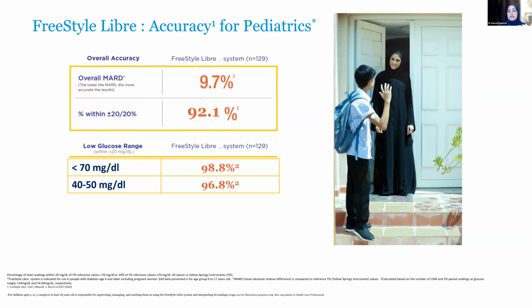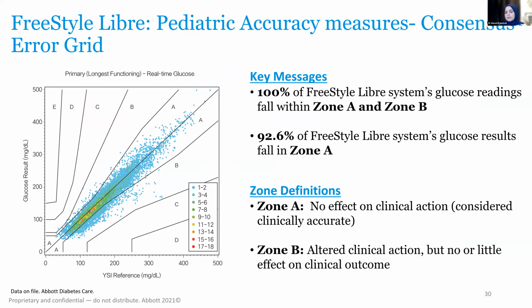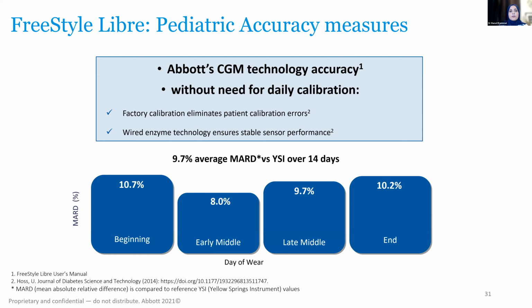And on the CEG, we had around 6,500 coupled data. And here we see 100% agreement between the falling of zones A and B as compared to the lab. So here we had all the results falling in the clinically accurate and the clinically acceptable zones on the consensus error grid.